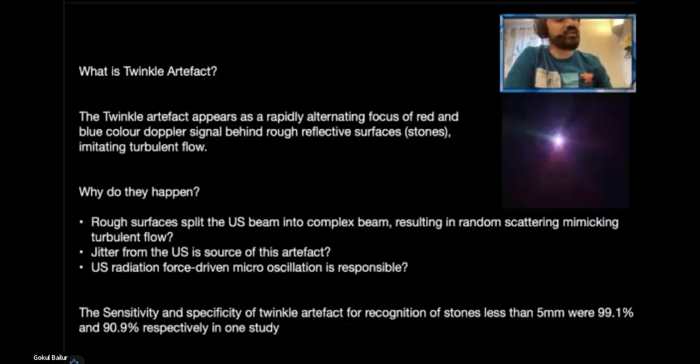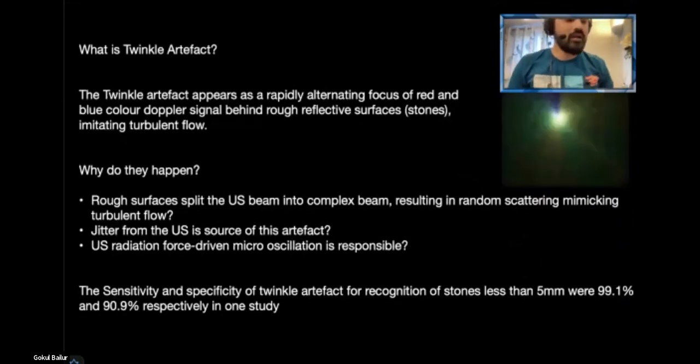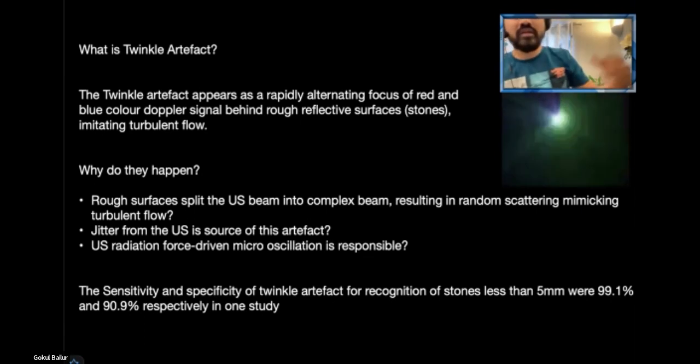So I just wanted to mention a little bit about Twinkle Artifacts. I never understood this concept before correctly. So why does this happen? I spent a few months as part of my PoCUS fellowship with sonographers. Everybody had a little bit of a theory as to why twinkle happens, but they all used it, and they said it's the best thing to find out small stones. They all loved to see some twinkle artifacts. They got all excited with the twinkle artifacts, but nobody gave me a proper answer as to why it happens. Everybody had some theories.